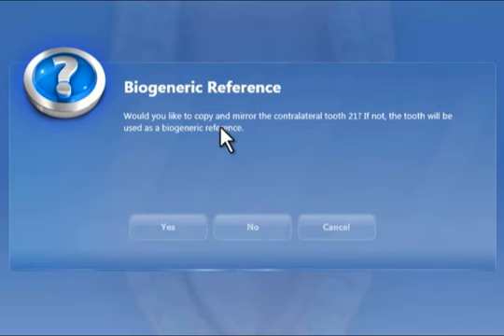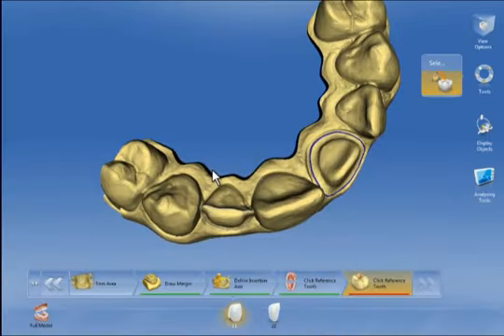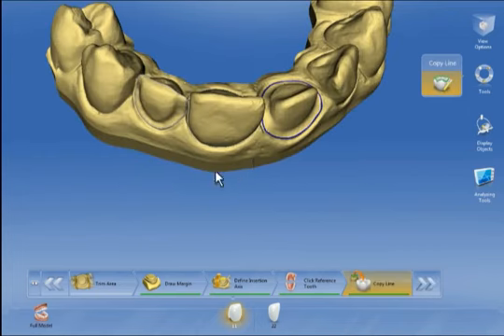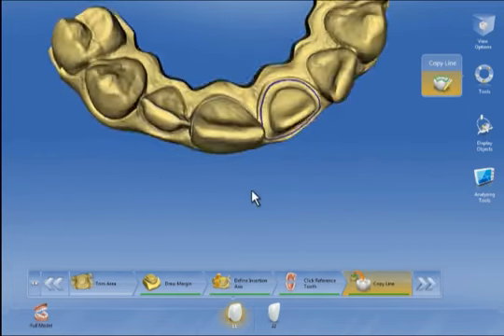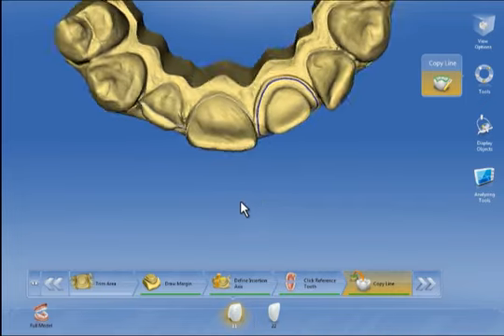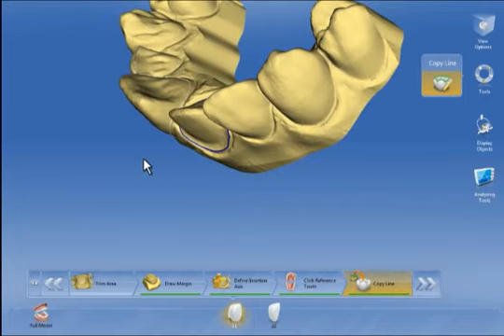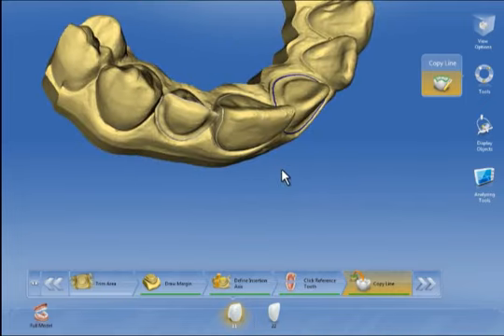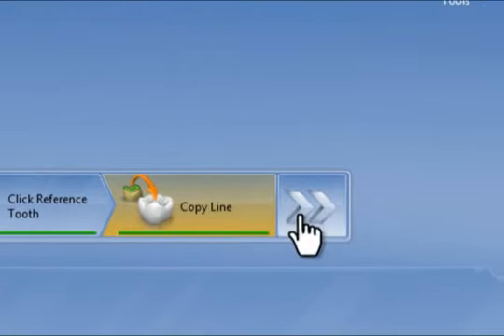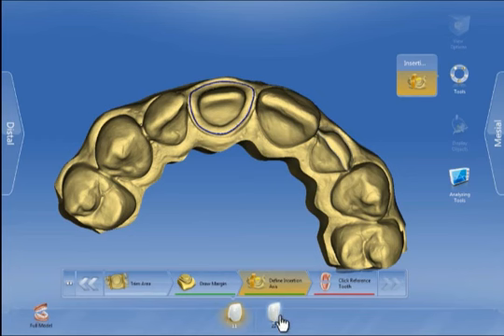We are asked if we would like the morphology to be copied and mirrored. We confirm this and click on the incisal area of tooth 2-1 on the model. The software then proposes the area to be copied, which we can either accept or modify before confirming with next.